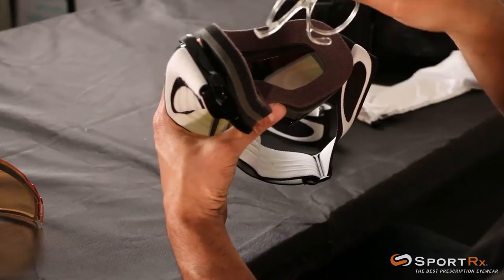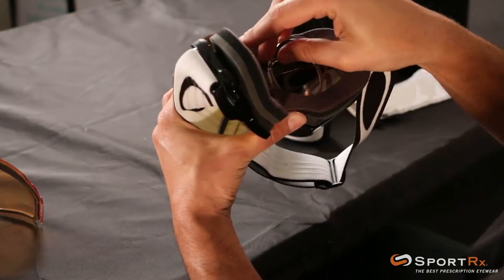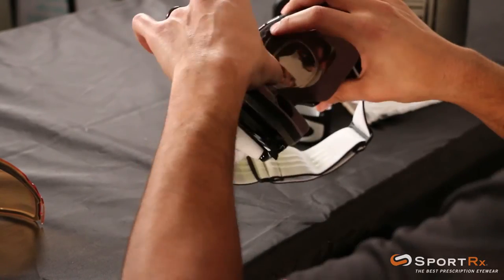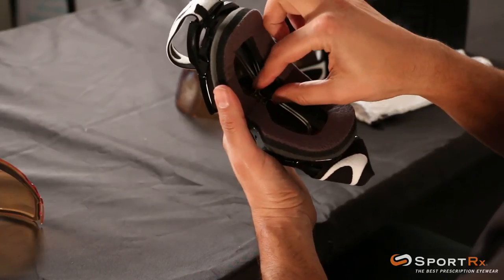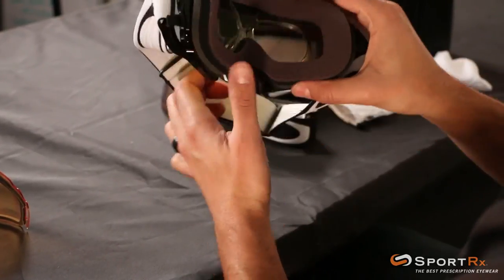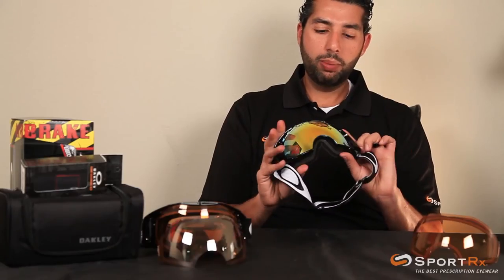So to get the insert in: the bottom spring goes in first — try to get it near or over that nose bridge — then put a little bit of pressure on the top ones. If you need to, you can kind of open up the foam with your thumb and it'll slide right in there. Then get the middle of the insert over the nose bridge and boom, your insert is in.